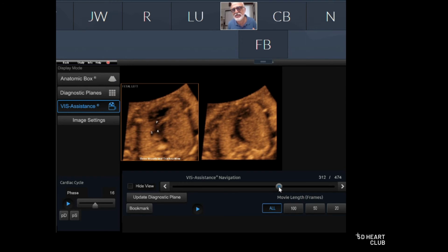Shall we conclude the session now? I think we are 15 minutes past. Great. I just have one question. Sorry, just a small question, Gustavo. Is that so? The system will label this as a pulmonary artery. Oh, I will tell you.